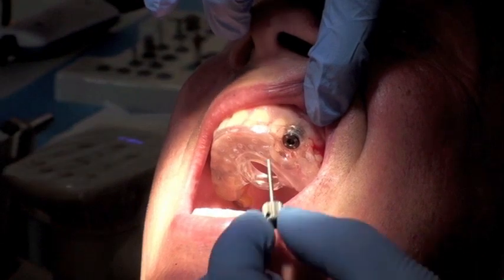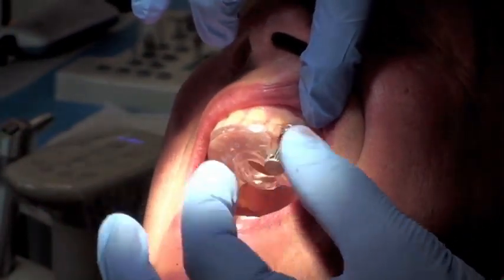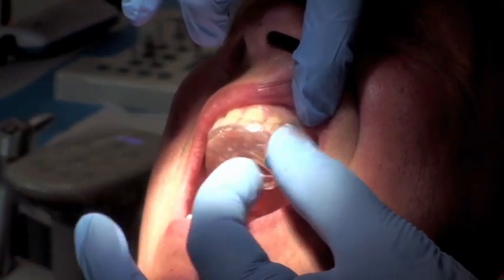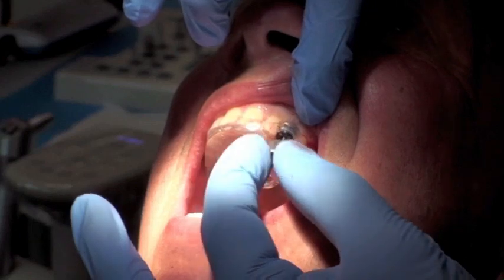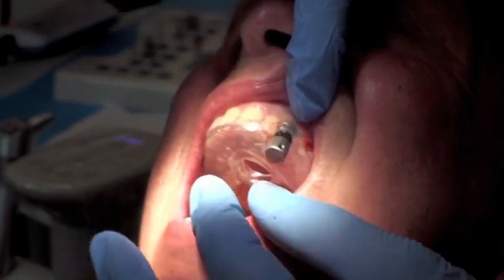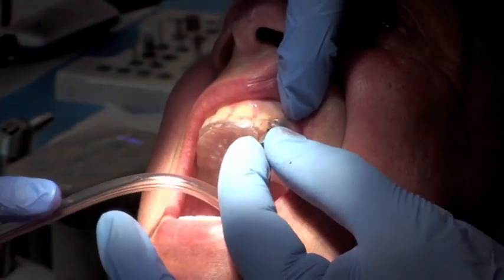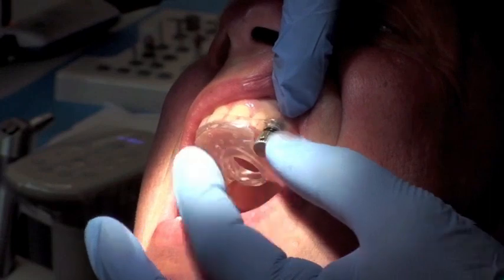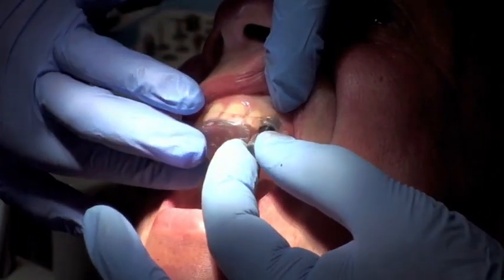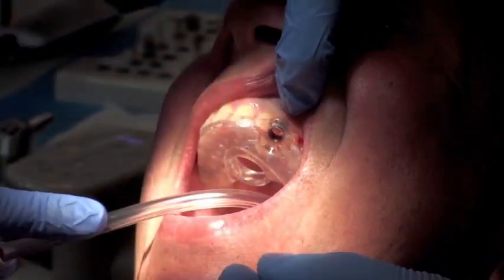This tool is threaded clockwise into the implant itself. In doing so, it releases the implant holder from the implant, which disengages the surgical guide from the whole complex. This allows us to safely remove the implant guide without dislodging or disrupting the implant that was just placed. At this point, the surgical guide can be removed.